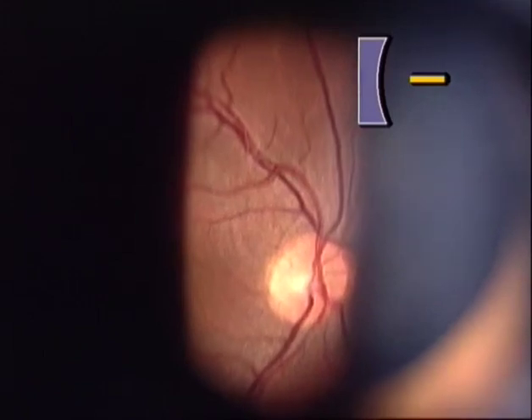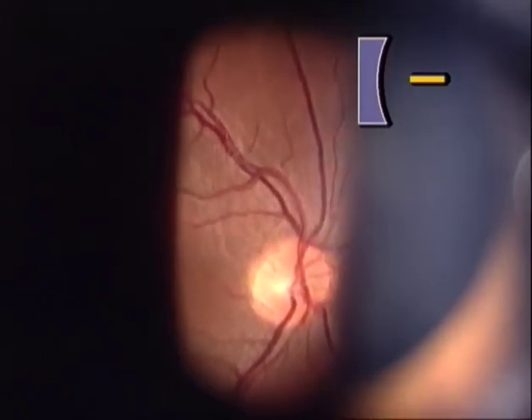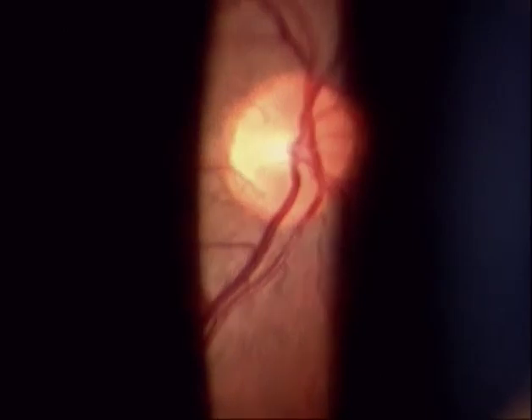The plano-concave contact glasses are designed to reproduce the spatial relations of the eye interior with the greatest possible accuracy obtainable in a living eye. For example, in this normal eye at the fundus, the deformation of the field is minimal, and when the slit light is made narrow, its curved outlines correctly show the normal curvature of the fundus. And if the focus of the slit lamp is moved more anteriorly, the anterior segment with the lens appears in an almost natural shape.